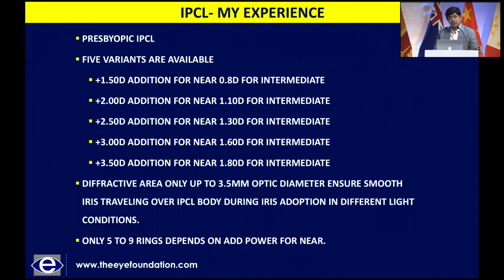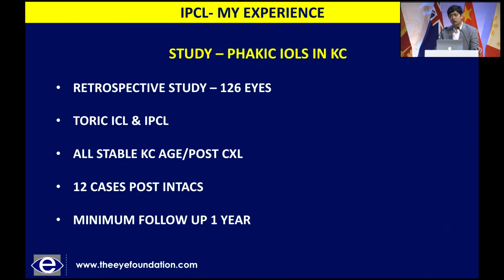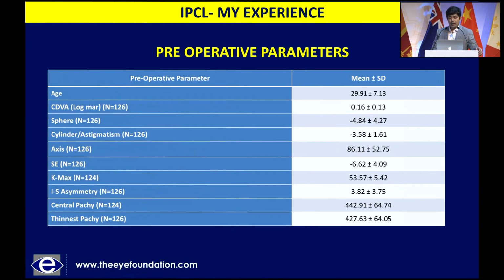concerned. Because the lens is very close to the iris itself, the amount of glare and halos that the patients face with these presbyopic phakic IOLs is extremely low. It can be used in keratoconic patients as well, and this is just presenting quickly a brief of our experience with IPCL in keratoconic patients.